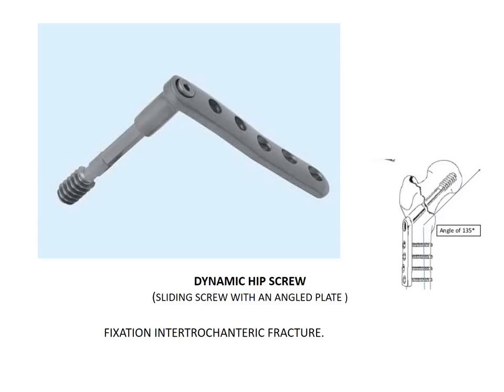When we look at the plates, one of the classical things that I want to talk about is a dynamic hip screw with a plate. You have a screw that goes inside the head of the femur, and then you have a plate with a barrel which slides on the screw. It allows controlled collapse at the fracture site, and that's where the screw moves along with it, called as a dynamic hip screw. A screw in the center of the head of femur with a good tip apex distance.